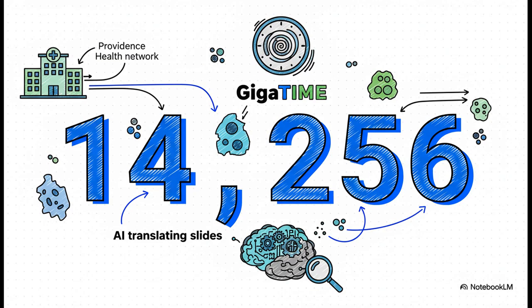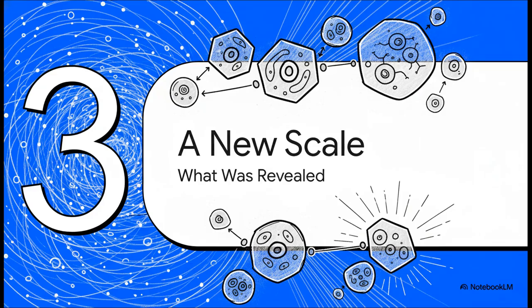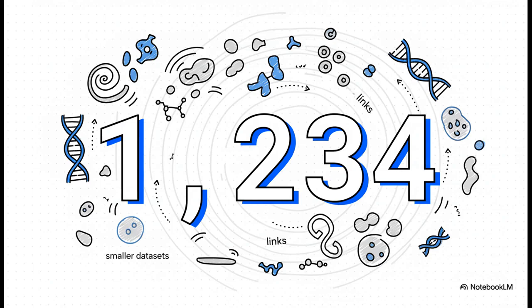And to prove it, that's exactly what they did. The researchers applied GigaTIME to a huge real-world dataset. We're talking over 14,000 individual cancer patients. In that process, it generated nearly 300,000 virtual mIF slides. All of a sudden, they'd created this massive virtual population to study, where every patient now has this rich, detailed protein data that just never existed before. It's mind-blowing. So now that you have this enormous new dataset, a scale of data that would be way too expensive to generate for real, what new patterns could they finally see? What secrets were revealed?